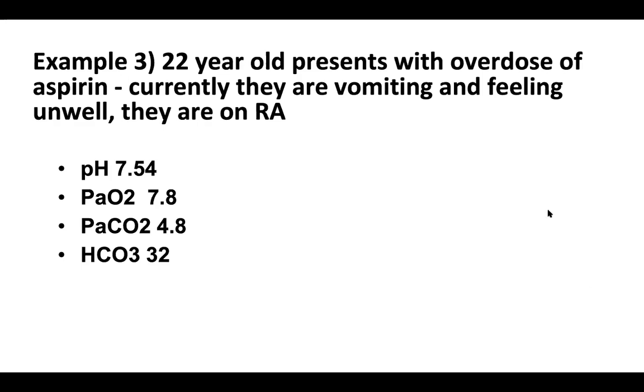PaCO2, is that normal, low, high? PaCO2 is kind of low normal, and their bicarbonate is 32, so it's slightly high as well.